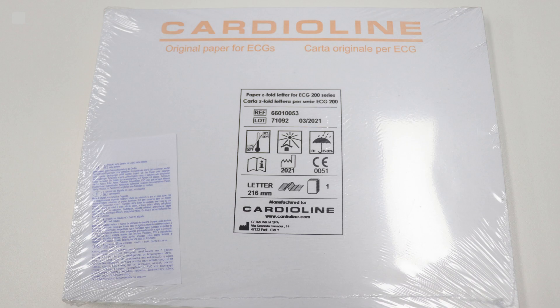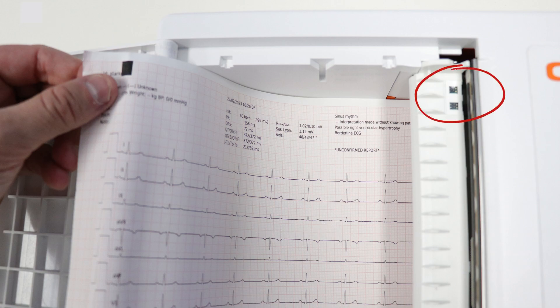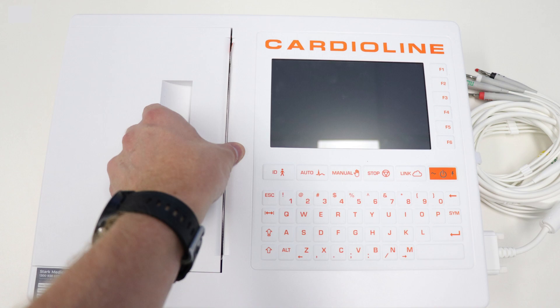Take out your packet of ECG paper, remove the plastic wrap and the top sheet, then load the full packet into the slot. Push it all the way in — the top sheet should have a black mark in the left-hand corner which will match up with the printer sensor. On the right-hand side in the red circle you will see the printer sensor, so the black mark and the printer sensor need to line up. Fold the paper sheet over the black sensor and then close the door.